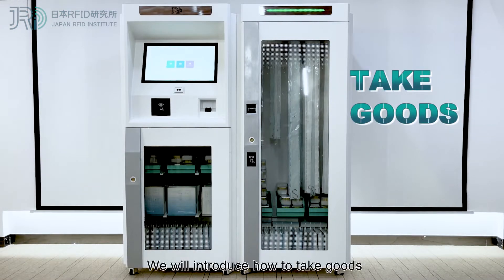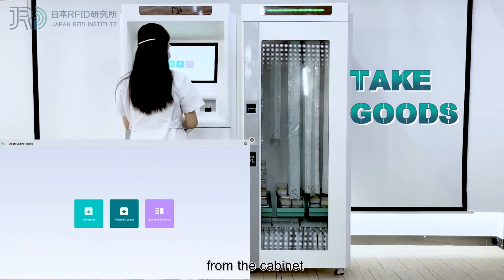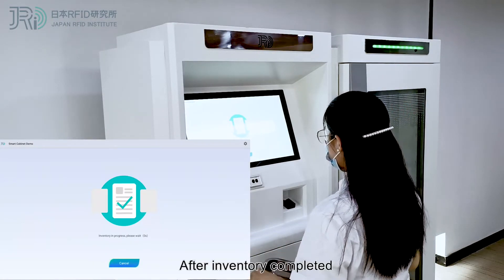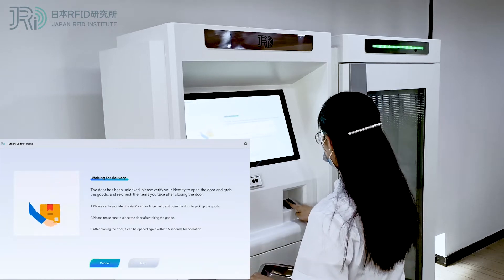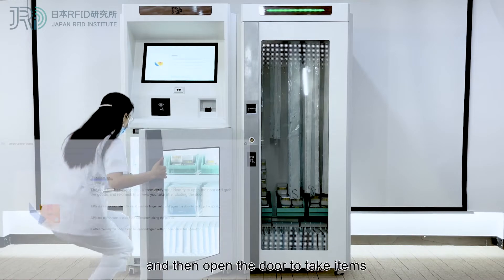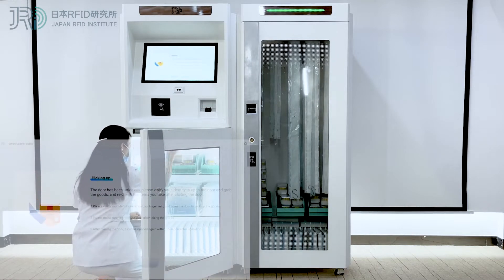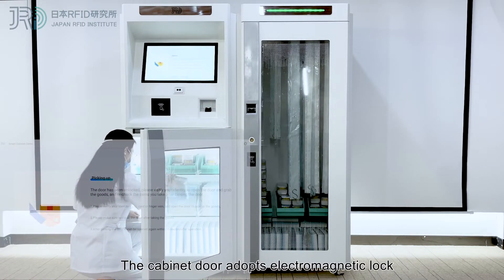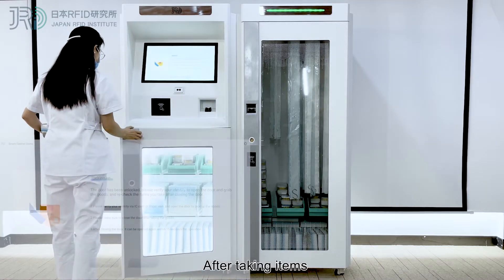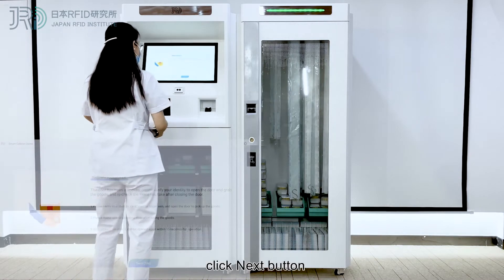We'll introduce how to take goods from the cabinet. Click Take Goods. After inventory is completed, verify your identity via finger vein, and then open the door to take items. The door adopts an electromagnetic lock. After taking items, close the door and click Next.